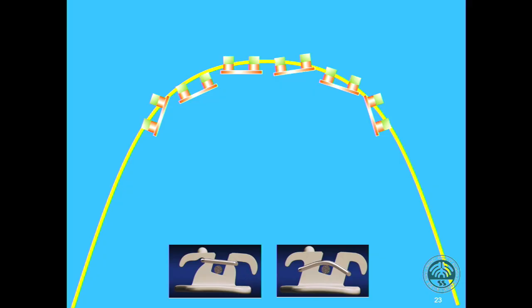Let's have a look at a case example. For an extraction crowding case, we would like the canine to slide distally with low friction. So we can choose a 0.2 ligature wire here. 0.2 ligature.